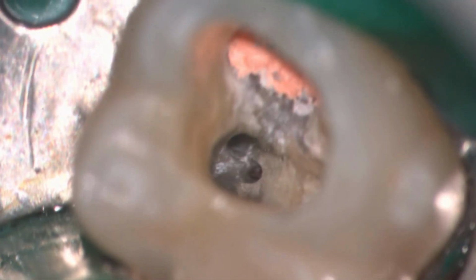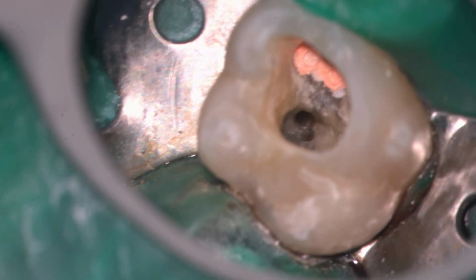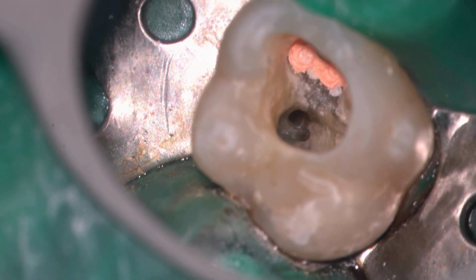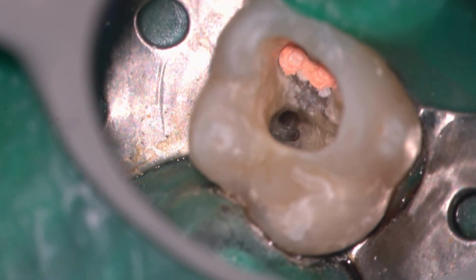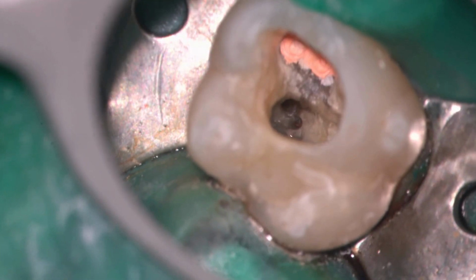We are now showing the second visit 1 month later after the root canal systems have been cleaned and shaped except for the distal buccal canal system, which involves a resorption defect. In this video, you'll see a paper point drying out the distal buccal canal, which has been cleaned and shaped. The resorption defect is quite dry after a month of calcium hydroxide and the treatment of 90% trichloroacetic acid.